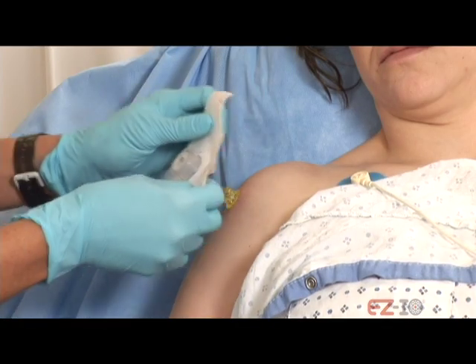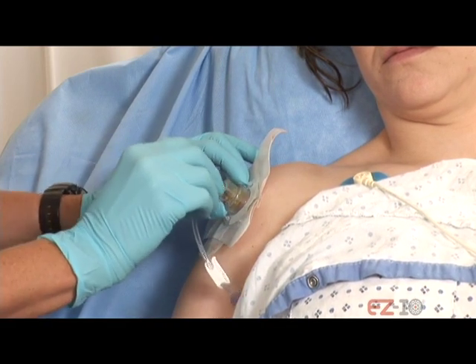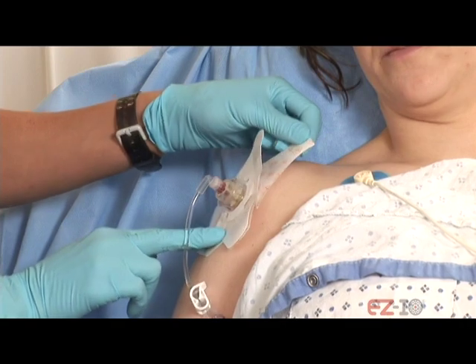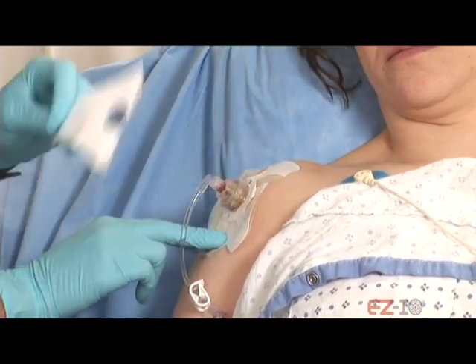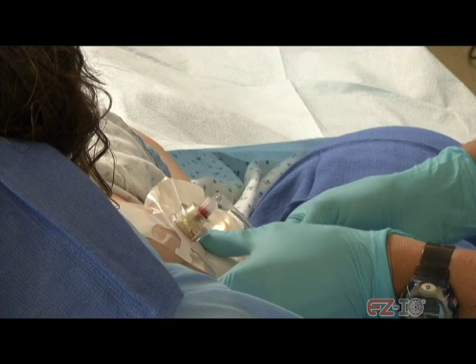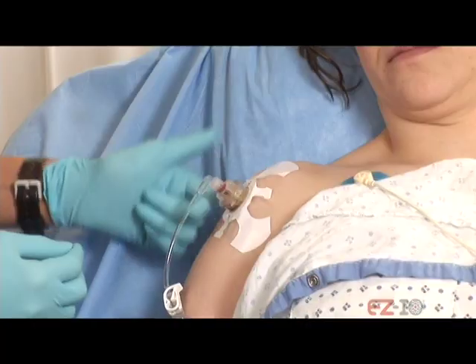After removal of the stylet, place the stabilizer over the IO catheter hub. Attach the Easy Connect to the catheter hub. Okay, now I'm just going to be securing these tapes down, okay? Remove tab 1 on the stabilizer to expose the adhesive. Then remove tab 2 on the stabilizer to expose the adhesive. Finally, ensure that the stabilizer securely adheres to the patient's skin.